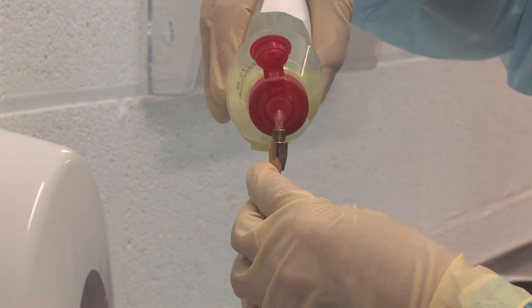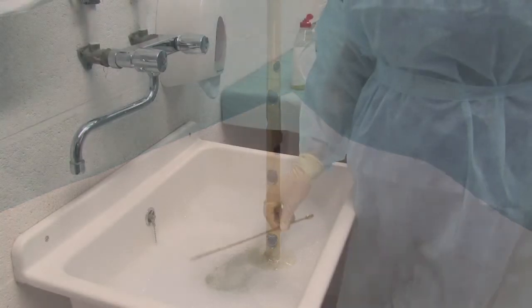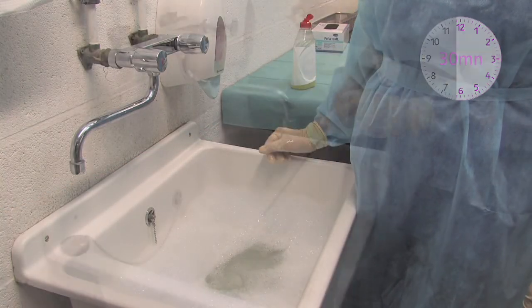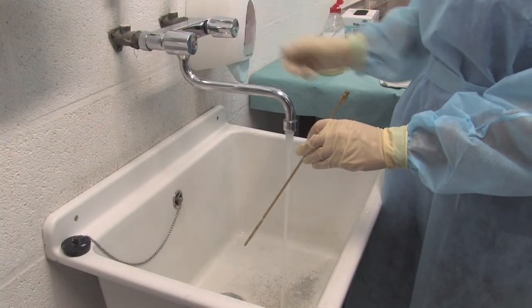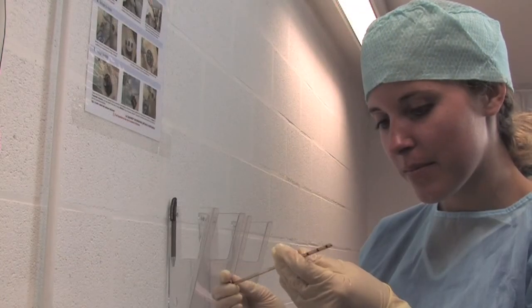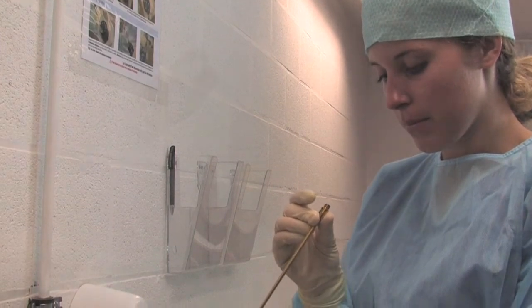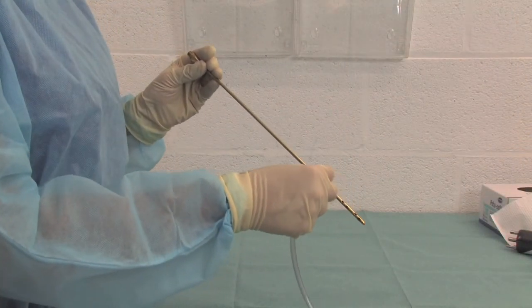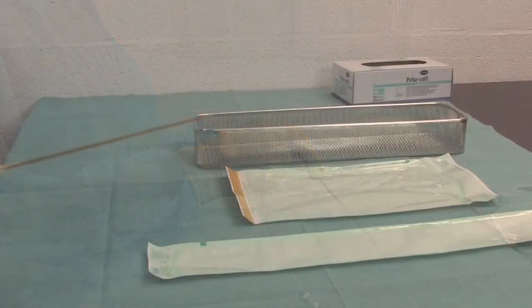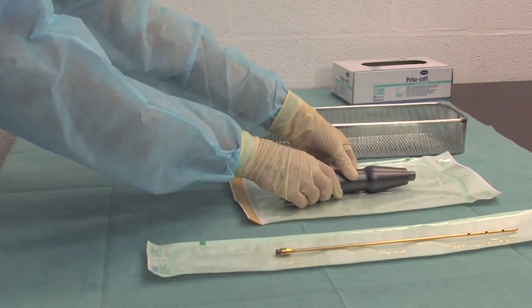Put cleanser in the cannula. Soak the cannulas in hot soapy water for at least 30 minutes. Rinse in clear water. Inspect the cannula inside to check there is no obstruction. Use compressed air to dry the cannulas. Cannulas and Lipomatic must be sterilized.